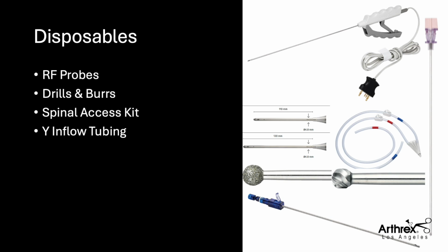Once you have these probes, typically you use 1 or 2 a case, so I usually bring 3 total for one case, just in case one drops. You never know, one breaks. It's something that the accounts do not have. With that being said, we also look at the drills, these burrs.